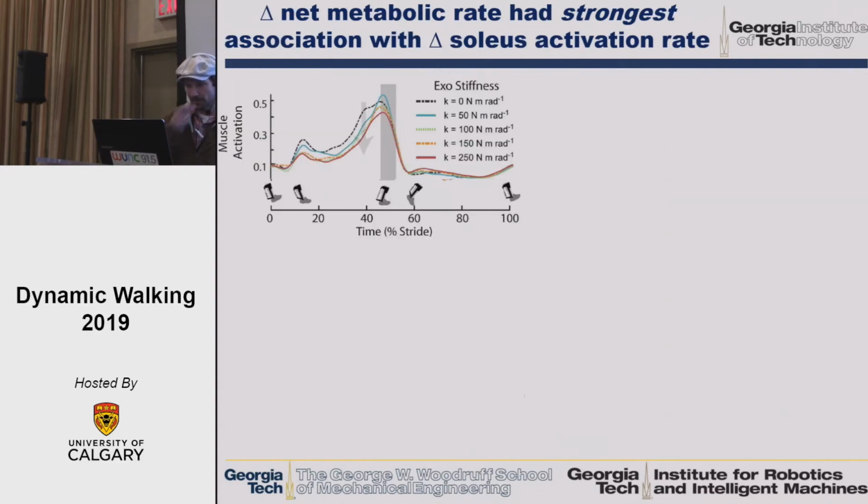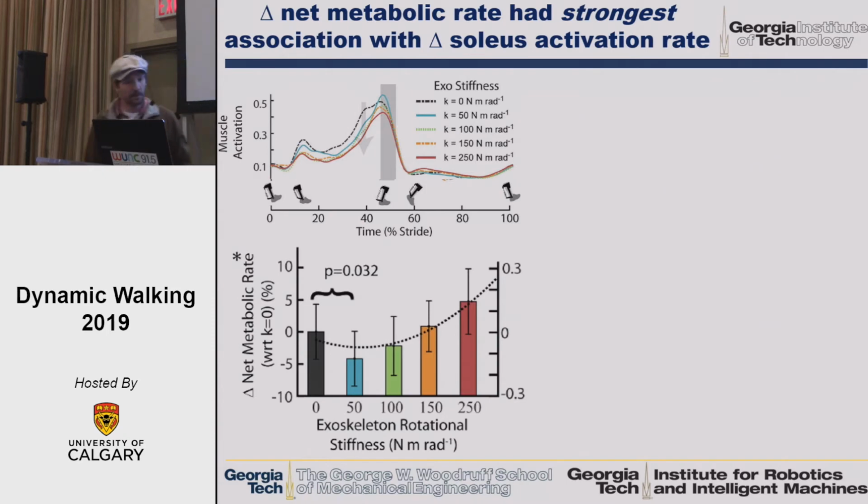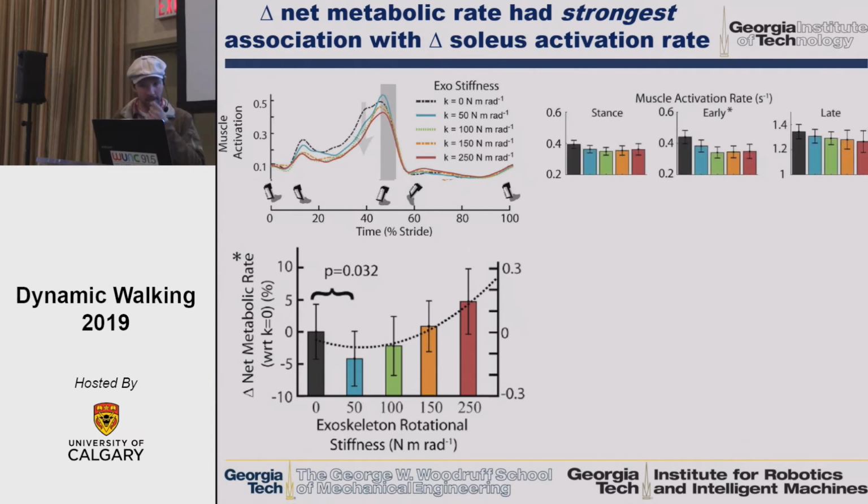Okay, so here's some data. What you're going to see here is on the x-axis is the percentage stride, and y-axis this is muscle activation, just normalized to the peak value of soleus that we observed over all the trials. And so maybe not that surprisingly, soleus activation goes down with increasing stiffness. We recovered a similar metabolic cost relationship to the original study, which indicated that you can't be too stiff, right? There's a sweet spot on the stiffness metabolic cost relationship.